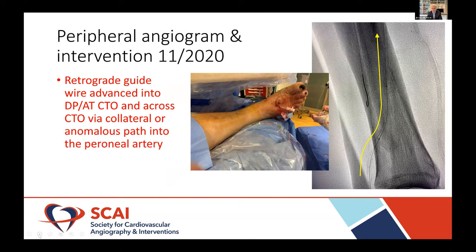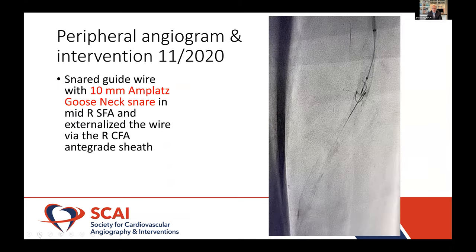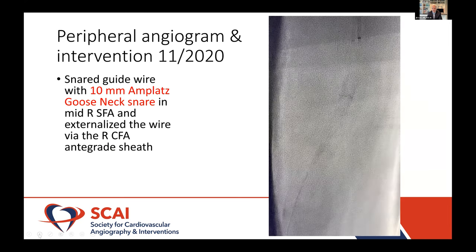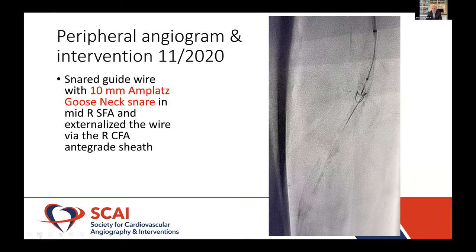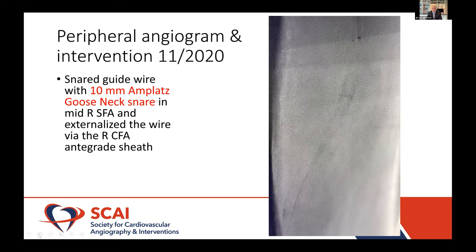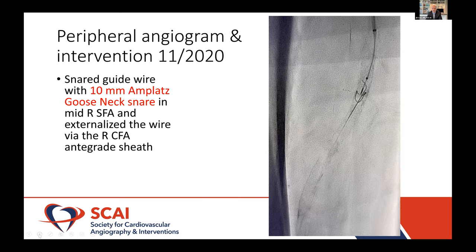Here you can see the track of the wire. Instead of going up and meeting that anterograde wire in the anterior tibial artery, it diverted over — it looks like it goes up the peroneal artery, up into the popliteal and free up into the SFA. This looks like either a collateral or an anomalous path up into that peroneal artery. Here's a quick video of us snaring that wire from the femoral sheath using a 10-millimeter gooseneck snare, externalizing that wire — now we have a through-and-through flossed wire situation.